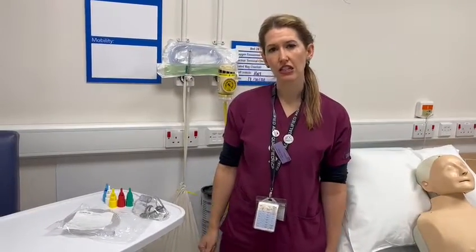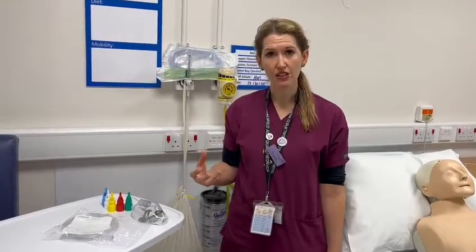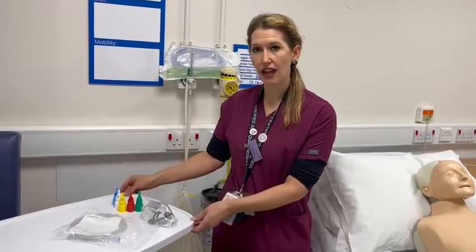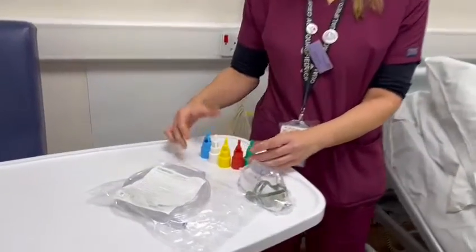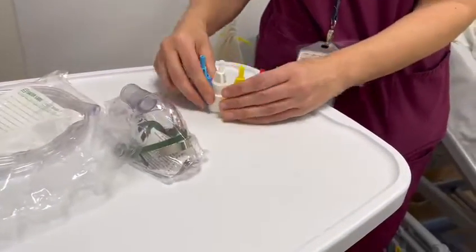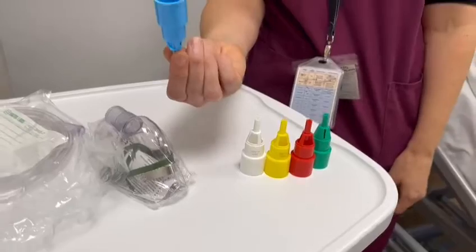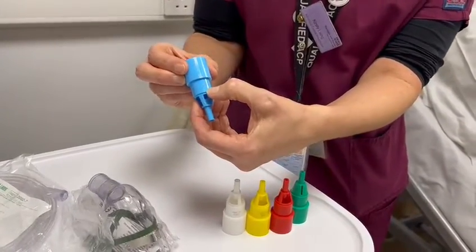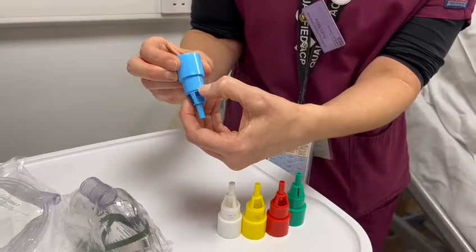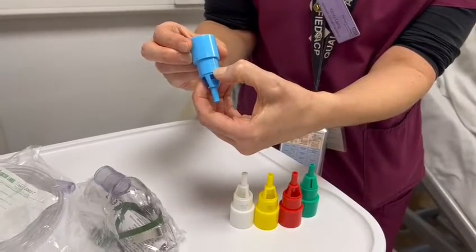When you're making the decision that you need to switch your patient onto a Venturi, we have an array of options available to us depending on what our patient's oxygen needs are. You have the blue one, which is the 24%, and you will see on the bottom of the device it will tell you how many litres of oxygen need to be delivered through the device.